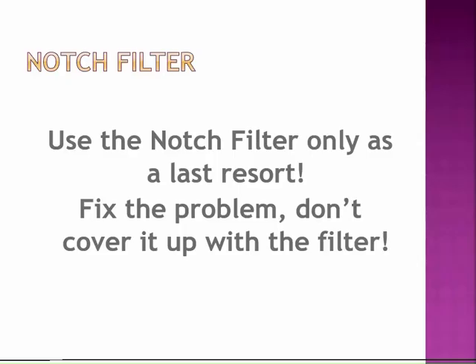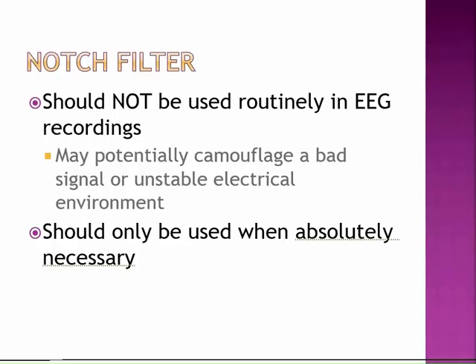You want to try to fix the problem at its source instead of putting a band-aid on it with a filter. So notch filters are not to be used routinely in your recordings. They can camouflage a bad signal and ultimately lead to a bad study if you are in the habit of just applying all your filters, making it look pretty without actually having quality signals come through. And that doesn't bode well for you as a tech, in your reputation that you're trying to build. You want to make sure that you are doing what you can to get as good of signals as possible.